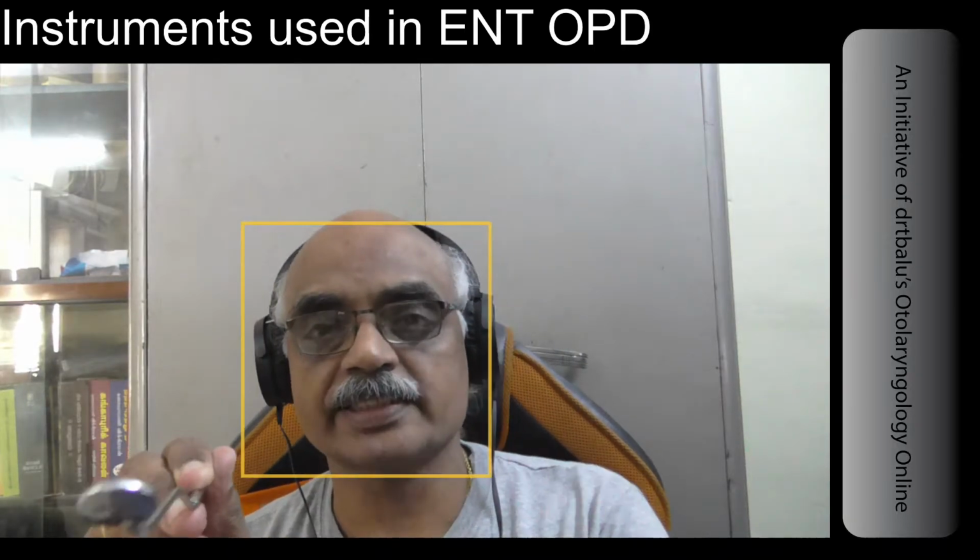Postnasal mirror, the curvature itself will tell you that you will be able to slide this mirror under the uvula. You use the tongue depressor to depress the tongue, and slide the postnasal mirror under the uvula to visualize the nasopharynx.